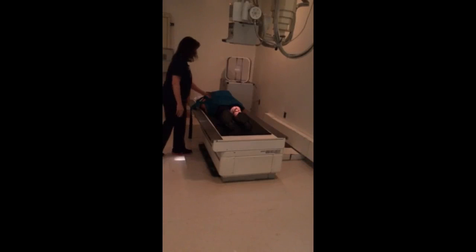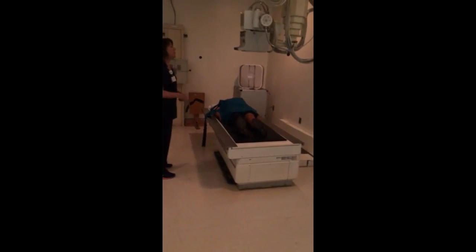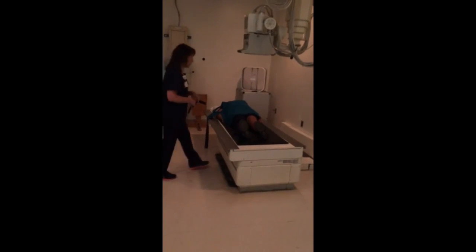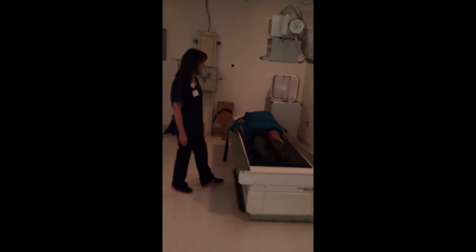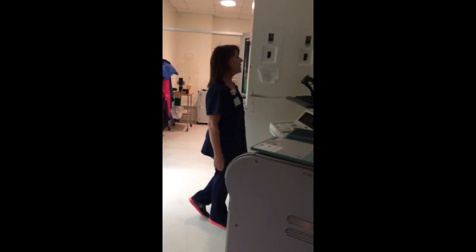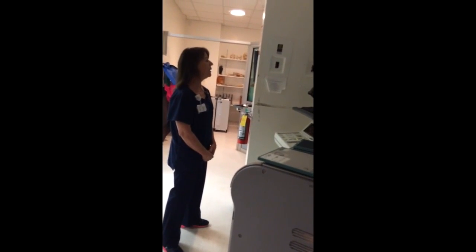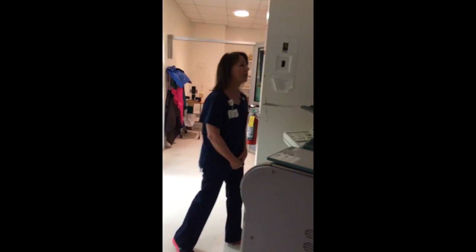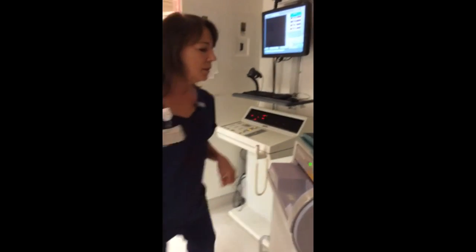Good. Shielded. I'm going to keep the same tube tilt of 3 to 5 degrees cephalic. 45-degree medial rotation projection. All right, stay real still for me. My technique for my oblique medial internal rotation is going to be 70 at 5 mAs. Okay, stay real still. X-ray. Okay.